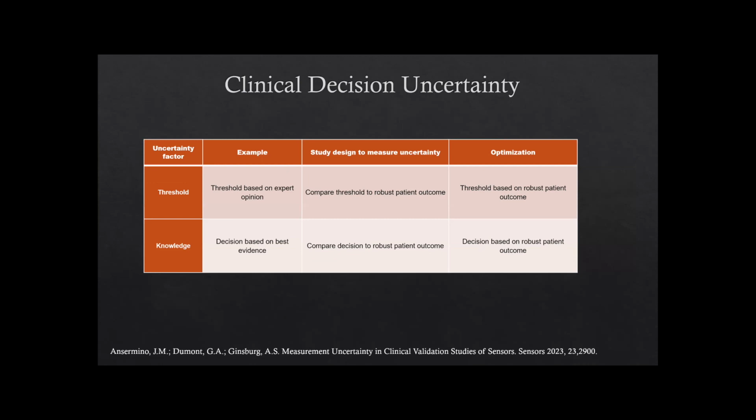And we need to really look at ways that we can improve this understanding, first of all, of what this uncertainty is, but how we can actually improve how we choose these thresholds and how we communicate the use of these thresholds within the clinical context. And then, of course, it's this whole issue of us as humans and how we perform. And obviously, Daniel Kahneman has published lots of really great stuff, and his latest book, Noise, is fantastic at looking at this. But there's no doubt that how we as clinicians use this information is critically important.